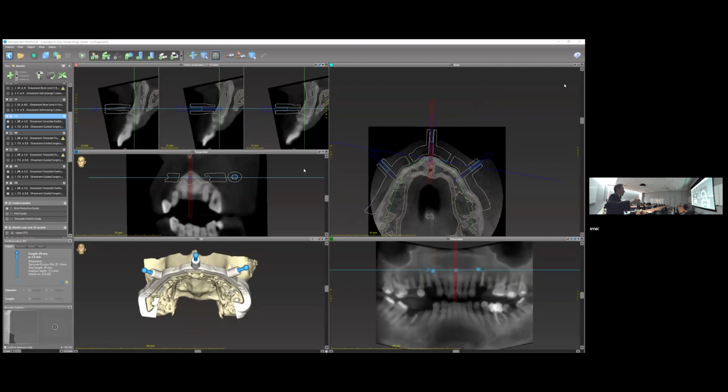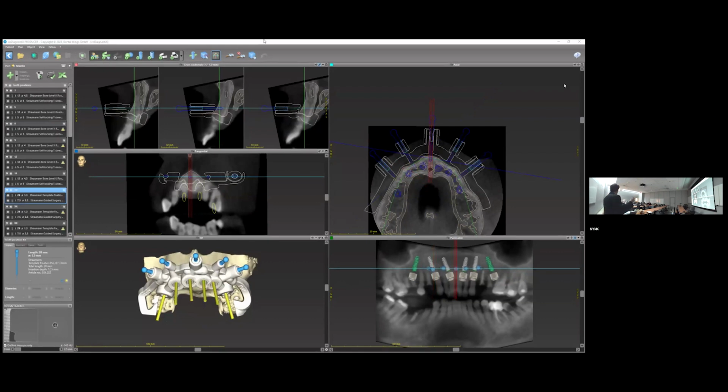And now we're going to take out the teeth and we're going to remove the bone up to the level. This tells us where to cut the bone to. And then we're going to take a second jig and mount over that. And you see these are those same holes. These are those same 5 holes.